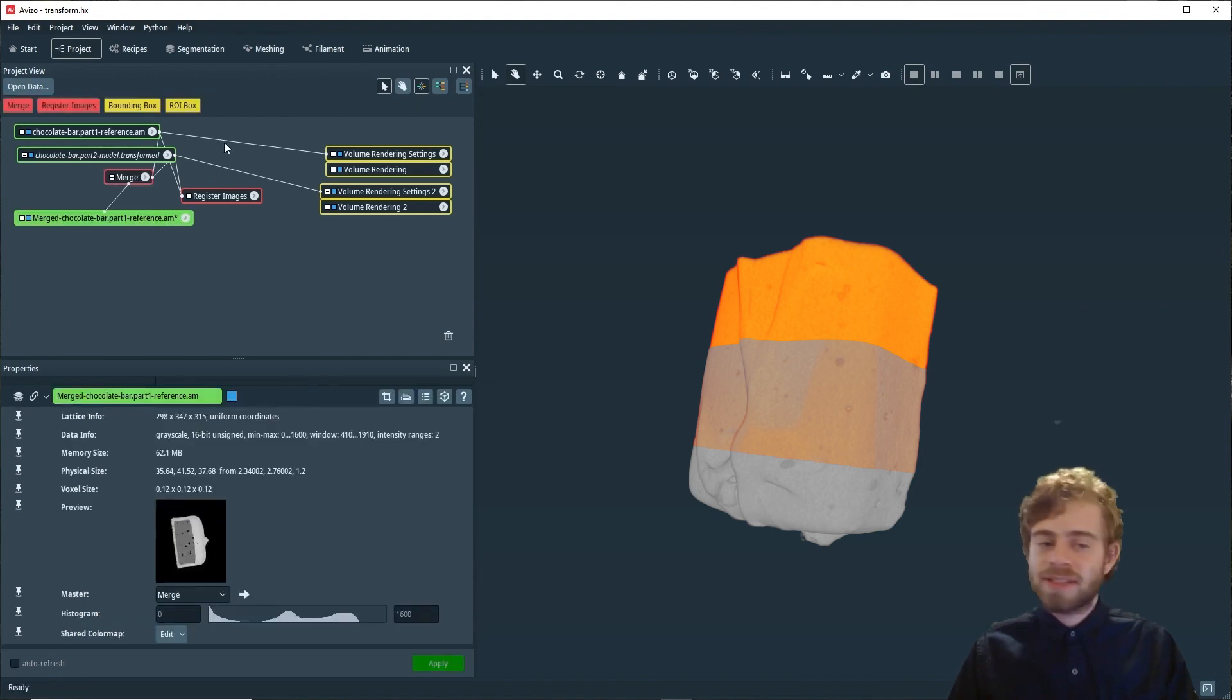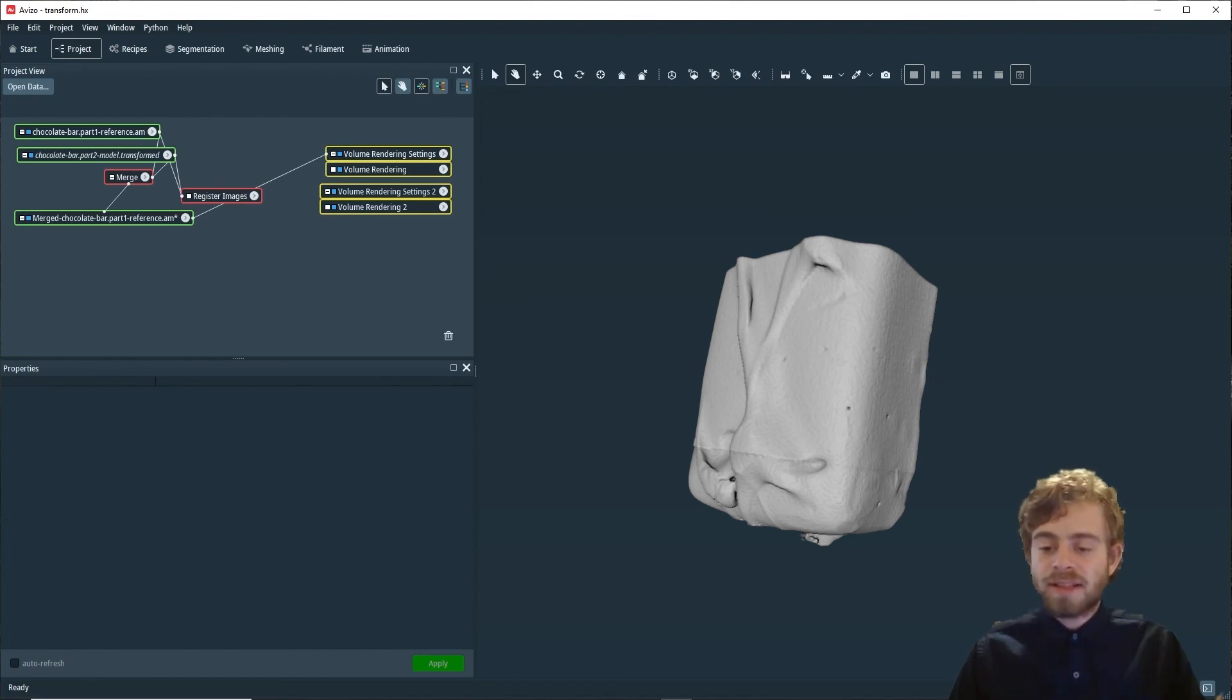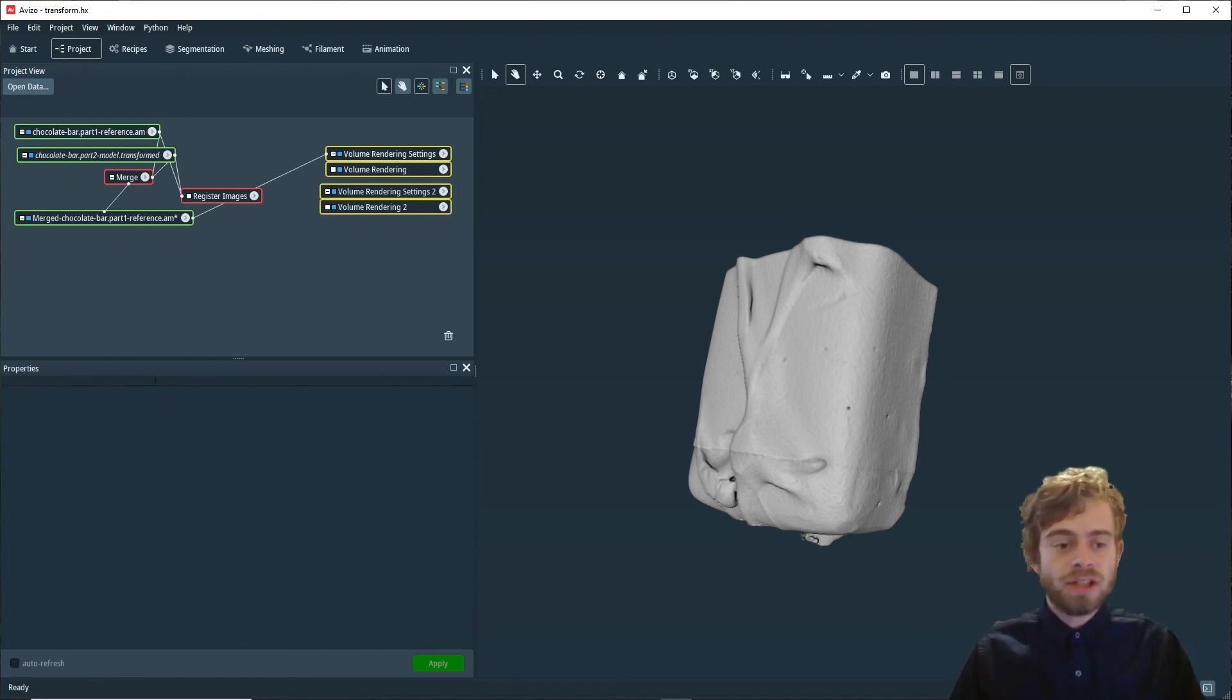Awesome. Let's see how well that worked. Let's connect the volume rendering to the merged object. As you can see, we have a good merged version of the image.